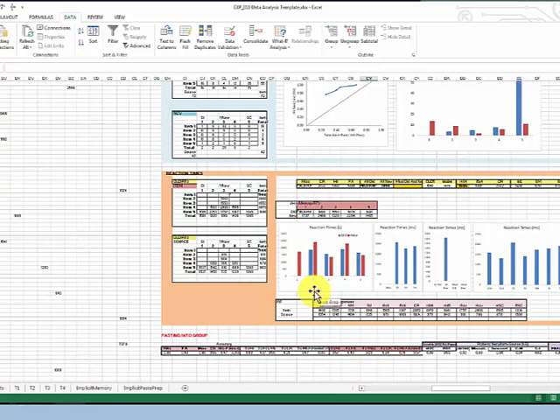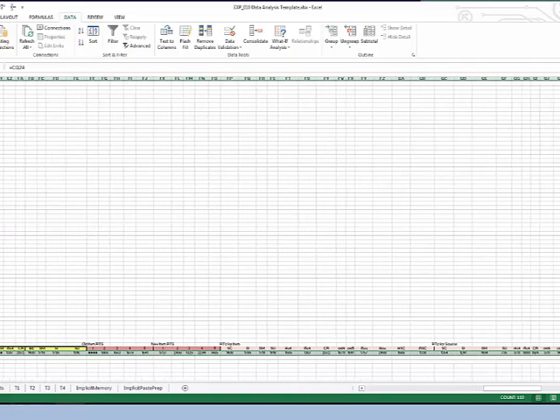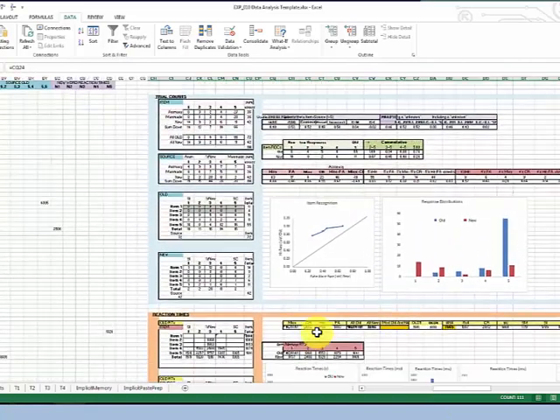Later on, you can upload these data files and send them to us, or just send us the raw log files, and we'll take care of all this processing on our side. Ultimately what we end up doing is having these cells here, which draw from all of our calculator outputs, and we copy them as a summary of that subject's performance in all sorts of conditions. We paste that into a different worksheet that we've built that collates group level performance. We paste it down sequentially line by line per subject, and we get our basic data results for behavior. So that's that.